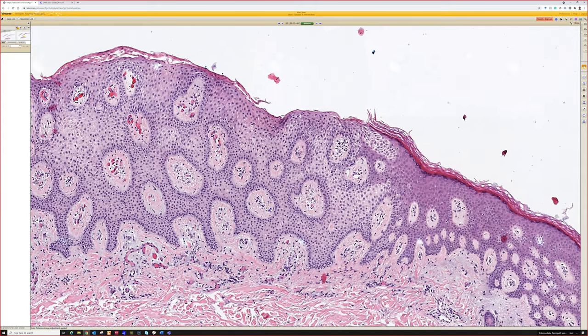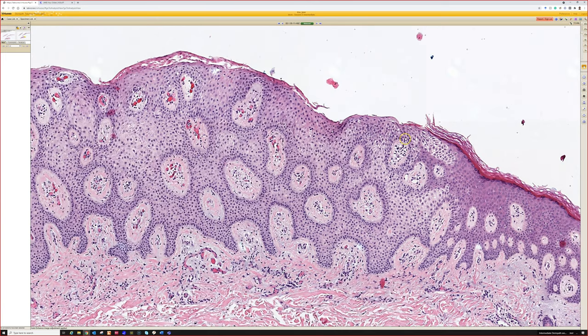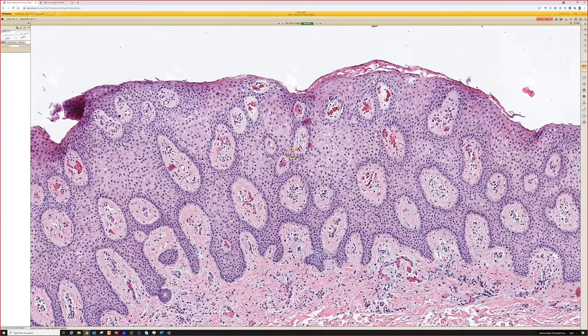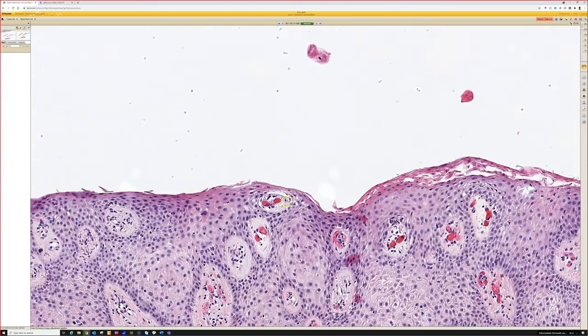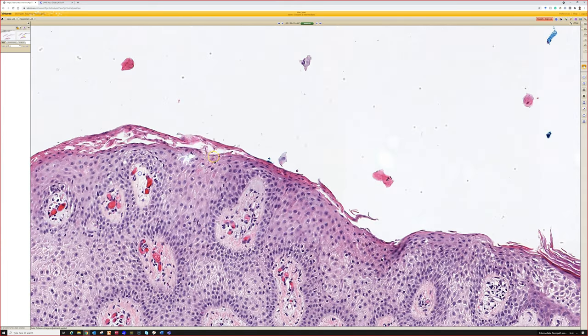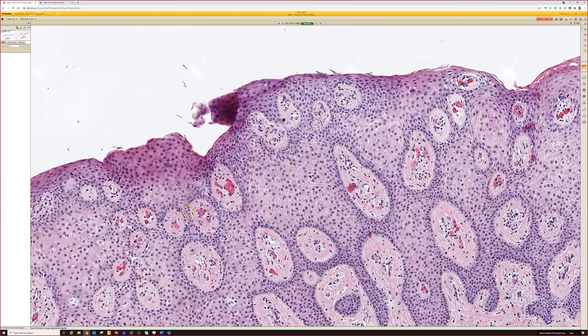And like I said earlier, it has a very discrete, sharp cutoff with the adjacent epidermis. And sometimes you can see a few foci of it. You can see a focus and then normal epidermis and then another focus. So I've seen ones that are kind of multifocal. Over top, the granular layer is usually gone, and there's a lining of parakeratosis. And oftentimes you'll see neutrophils in the epidermis and in the stratum corneum, kind of like psoriasis a little bit.